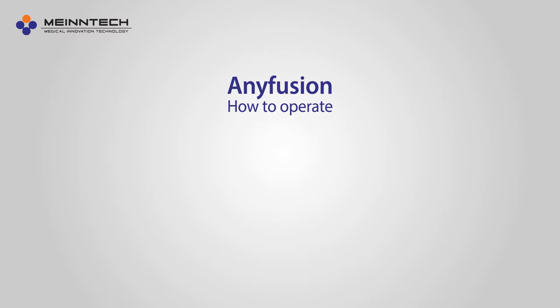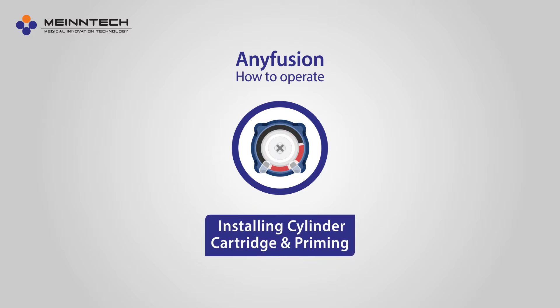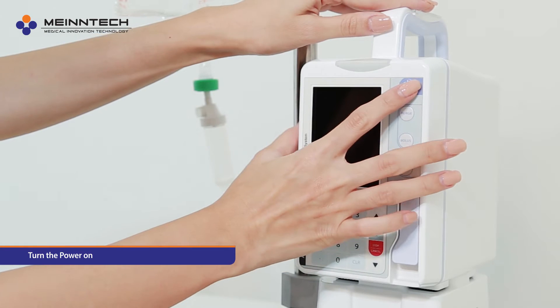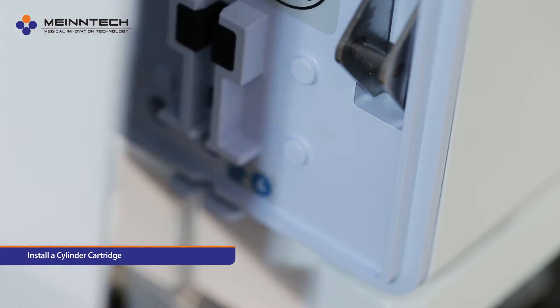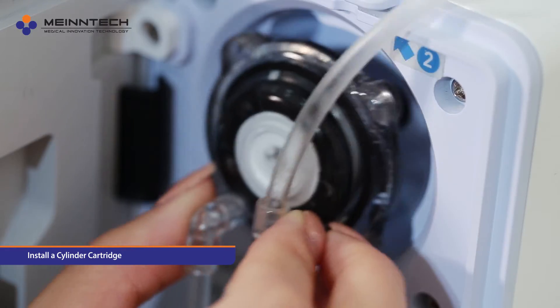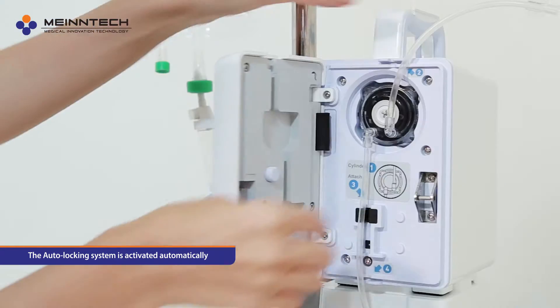Anyfusion — how to operate. Setting Anyfusion, Step 1: installing the cylinder cartridge and priming. Turn the power on. Open the front cover and install a cylinder cartridge. The auto-locking system is activated automatically.